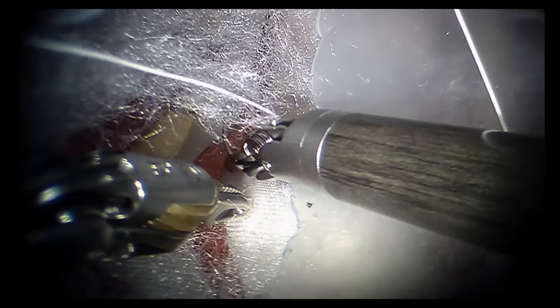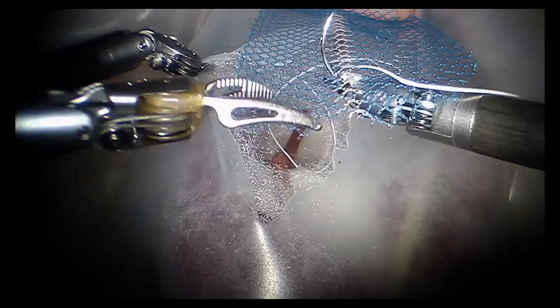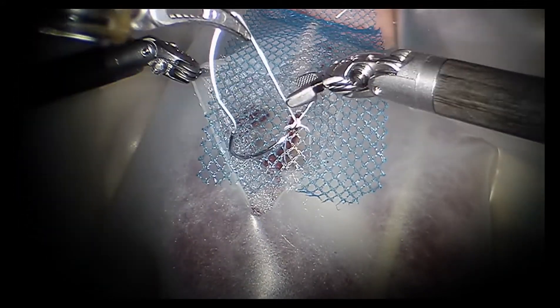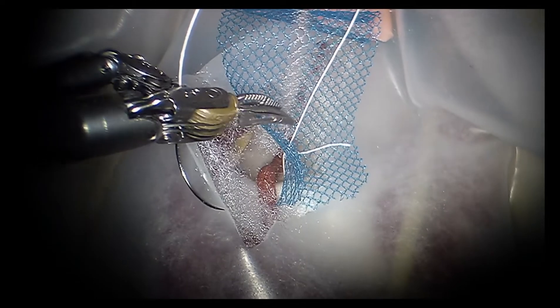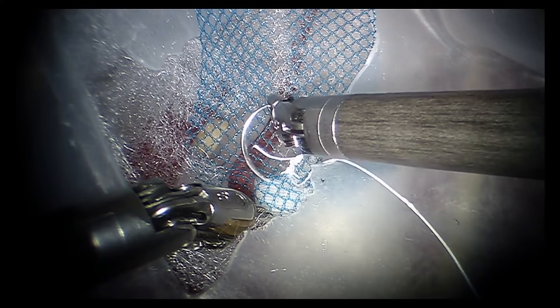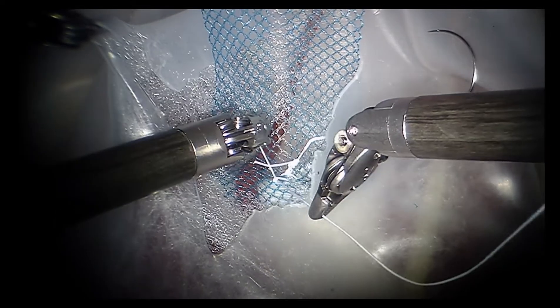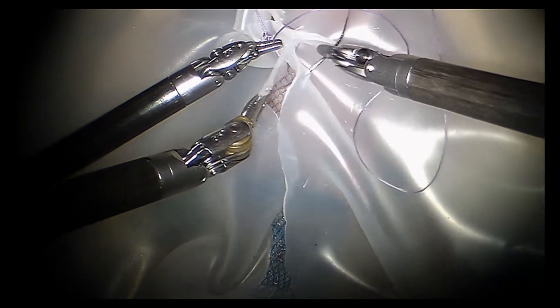Various suture or mesh types can be used in this simulation model, and surgeons or trainees are not limited to the materials displayed here. After two sutures are placed in the anterior longitudinal ligament, the peritoneum is closed over the mesh to complete the procedure.